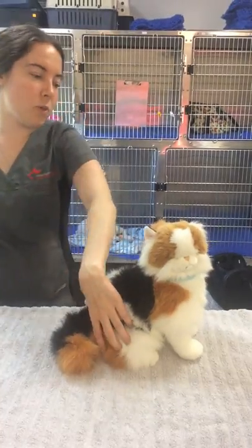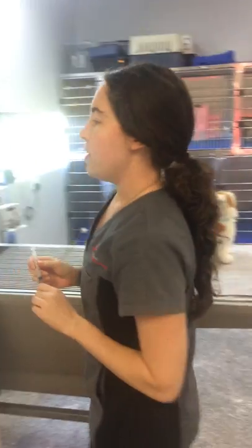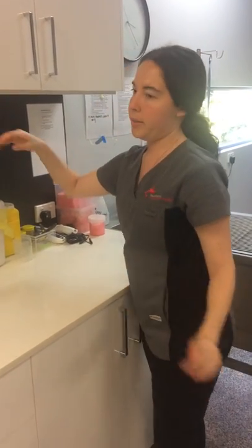After you take it out, give it a little rub to make sure it's not too sore and it disperses. And we've disposed of our needle in the sharps container and our other rubbish is in the general waste.